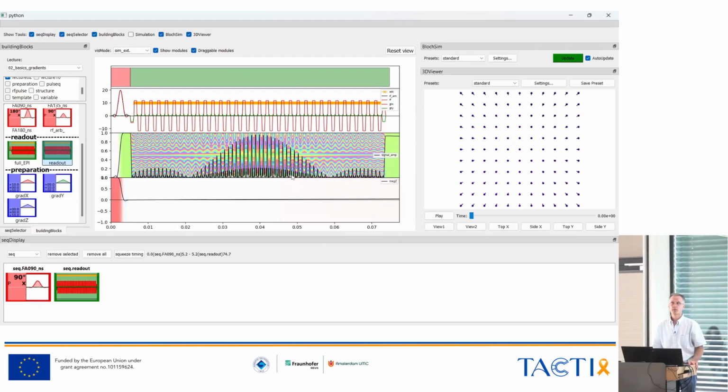For the case you applied for the gradient echo, the rephasing will not be perfect, right? Normally, when we saw the magnetization vectors, it seems like it is perfectly rephased. But normally, in practice, it will not be like that, right? Because we will have some kind of imperfections. We will be coming to this in a second, yeah. Exactly. Thank you. I just wanted to introduce this imaging part first without spending too much time on talking about K-space because time is running.